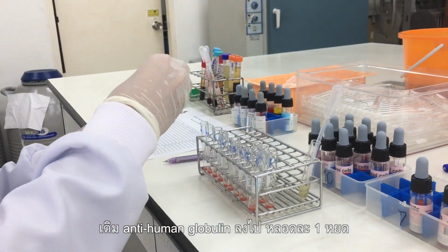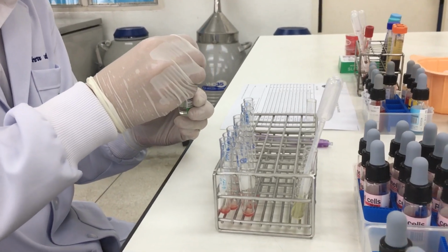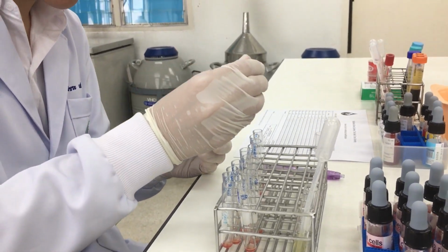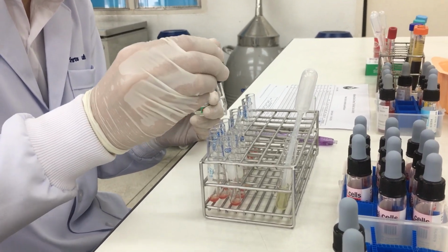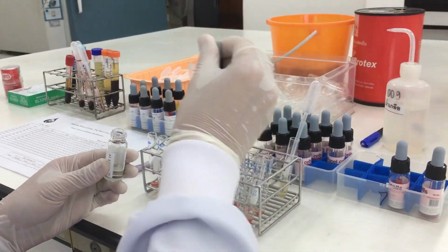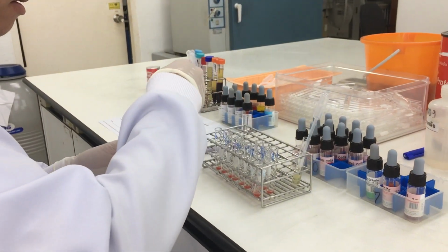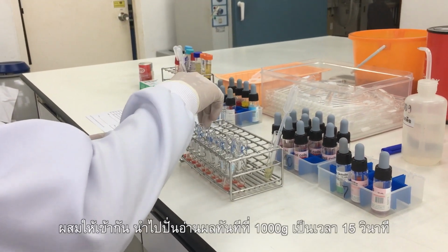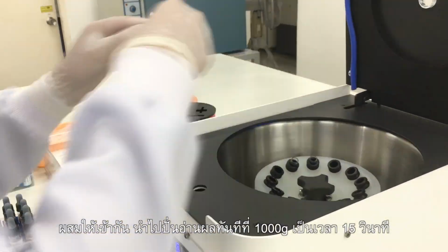Transfer 1 drop of anti-human globulin reagent. Mix and immediately centrifuge at 1000 G for 15 seconds.